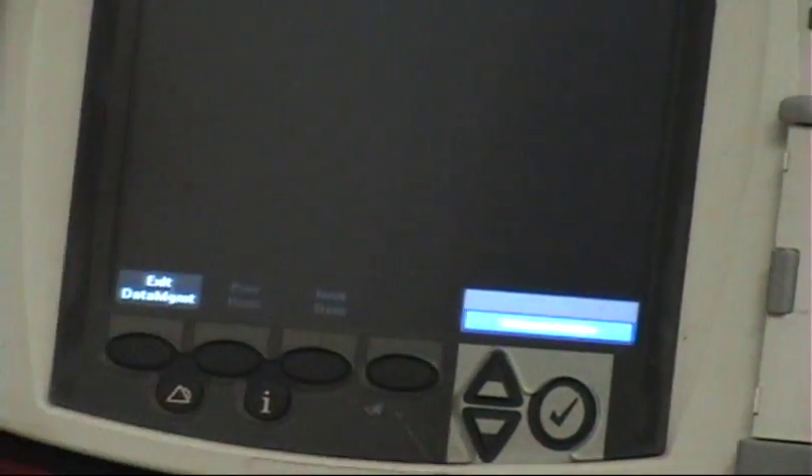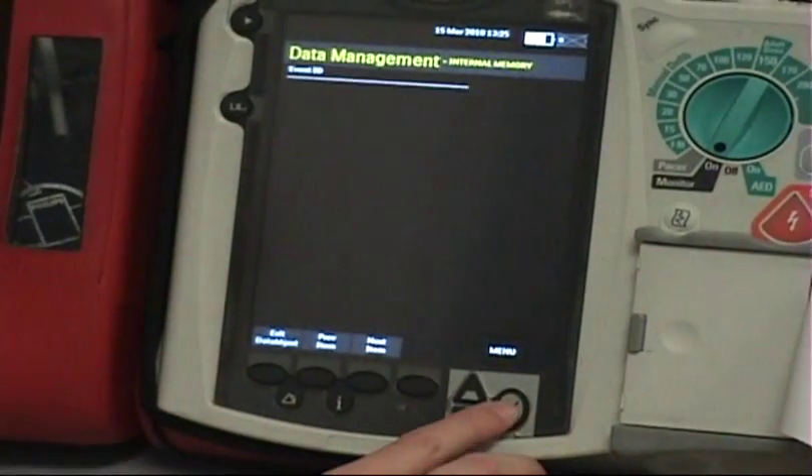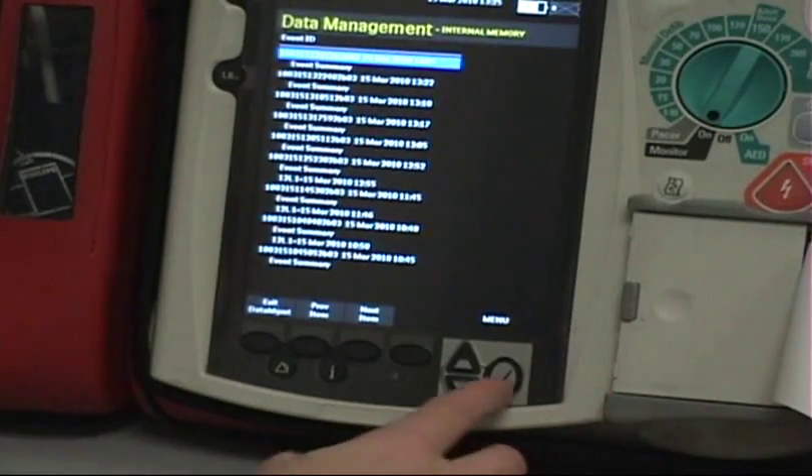Notice it starts beeping at you. The quicker you get to this mode, the quicker it'll stop. We're in data management mode and it's giving us a warning — we're leaving the patient monitoring mode, which is what we want. Go ahead and acknowledge that warning.